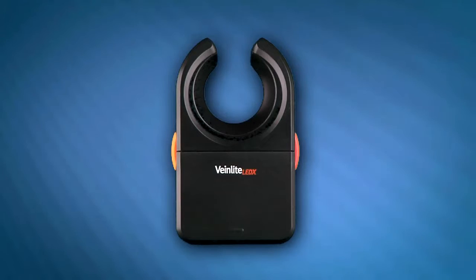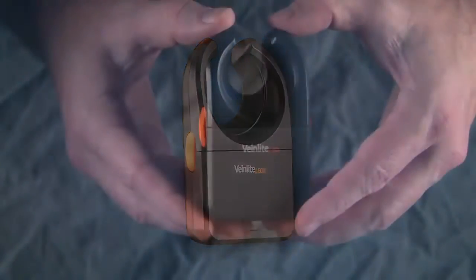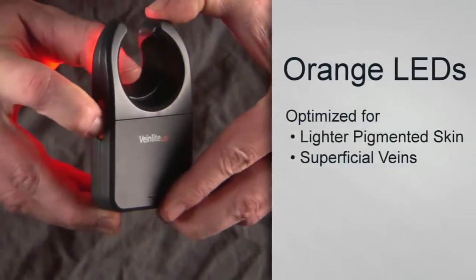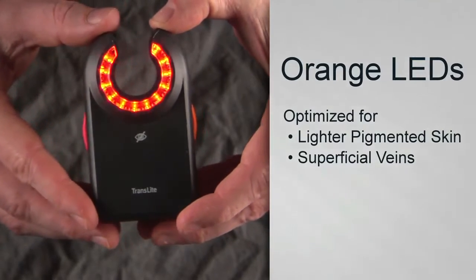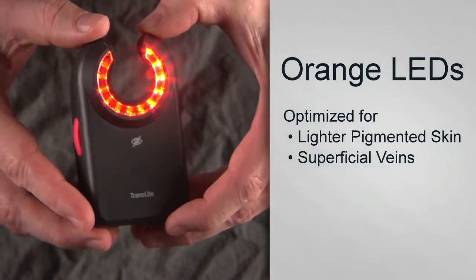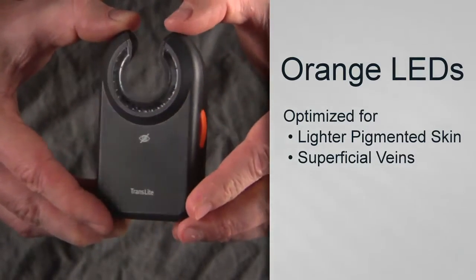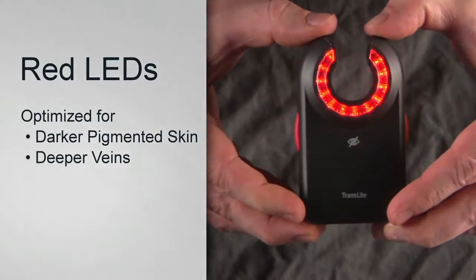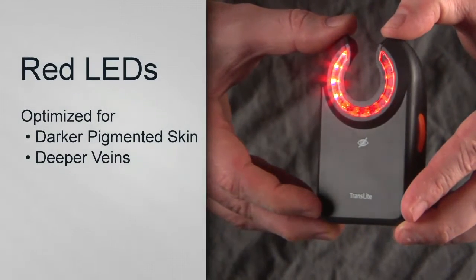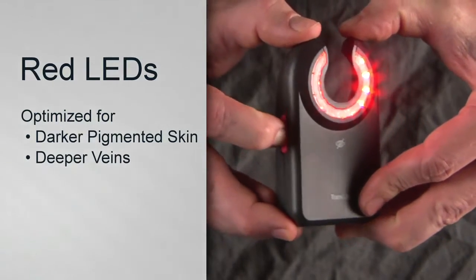VeinLight devices offer a simple one- or two-button operation. Two-button devices have a red and an orange button. When you press the orange button, orange LEDs will turn on that are optimized for illuminating lighter pigmented skin and superficial veins. To turn off, simply press the orange button again. When the red button is pressed, red LEDs will light up, which are optimized for darker pigmented skin and deeper veins. Press the red button again to turn off.